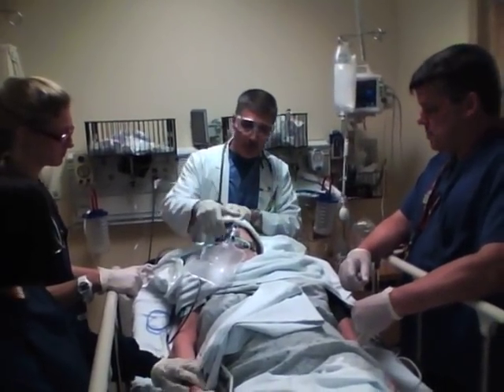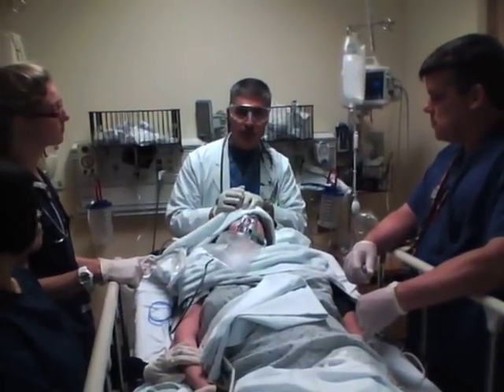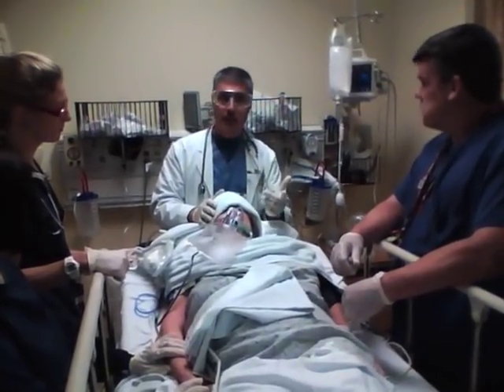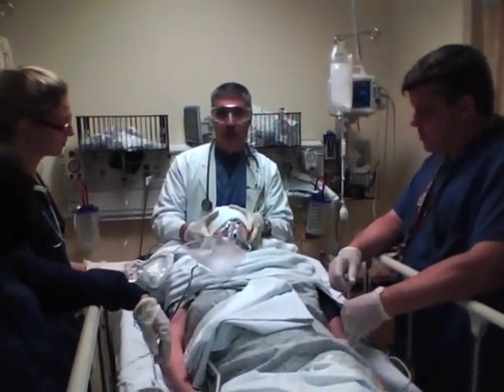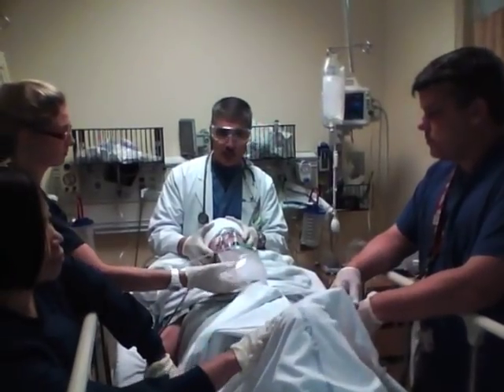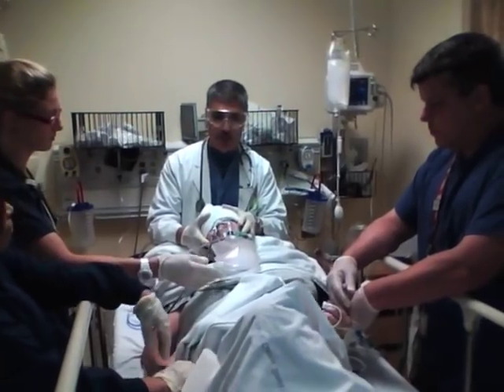The whole idea behind rapid sequence intubation is to get the endotracheal tube into the trachea and minimize the risk of the patient either becoming hypoxic or vomiting and aspirating. She's not protecting her airway very well — she's protecting it a little bit. We're going to put an endotracheal tube in and protect her airway the rest of the way, and make sure we can control her respirations as well.